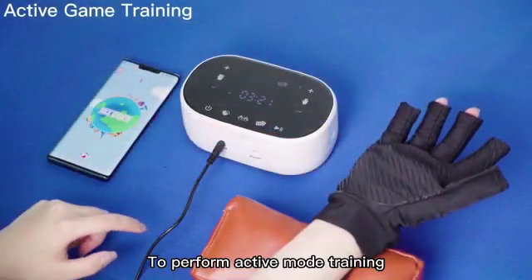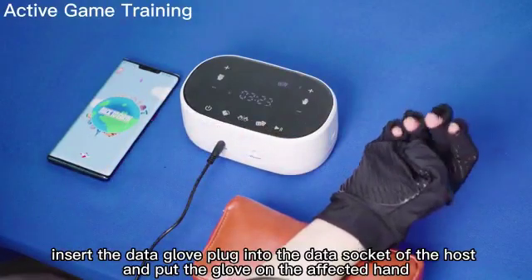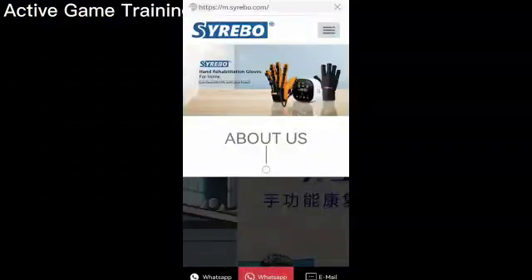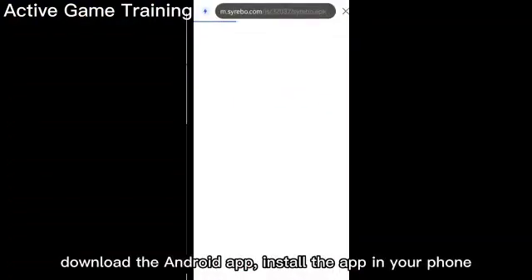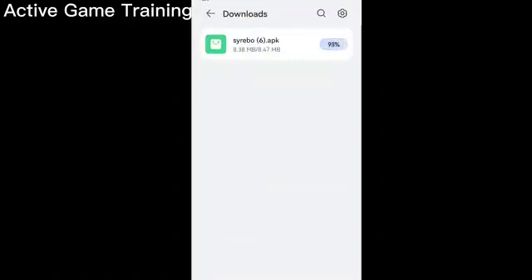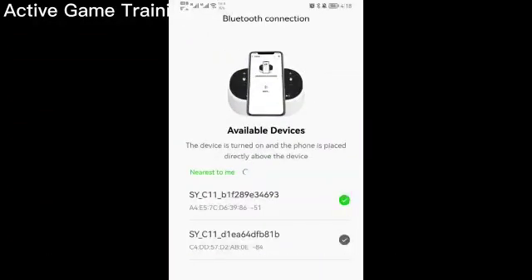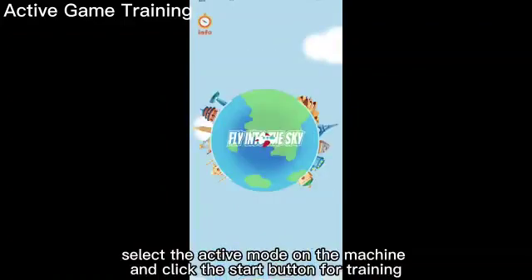To perform active mode training, insert the data glove plug into the data socket of the host and put the glove on the affected hand. Visit syrebo.com home page and enter the download page. Download the Android app and install it on your phone. Open the app, and after a successful Bluetooth connection, select the active mode on the machine and click the start button for training.